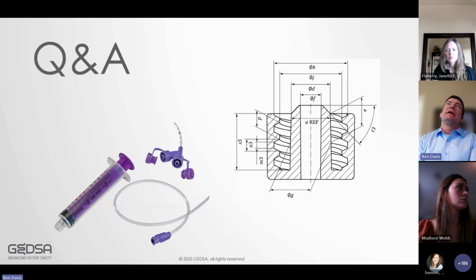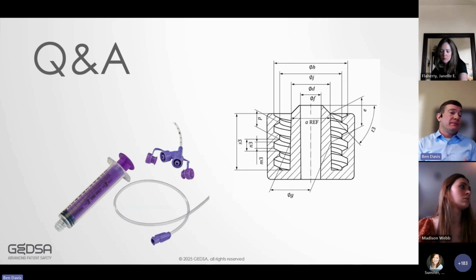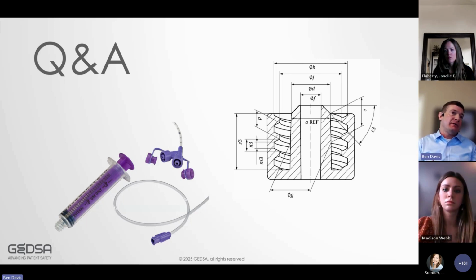But the other interesting thing to consider in that conversation is if you're dealing with a low profile device, you can't see the inside of that connection, but especially on a right angle connector, like on the bayonet fitting, the key that goes in a low profile device is actually the same as, if not sometimes even smaller than, the ENFit through bore. So that's actually the bottleneck in some of these systems. If you have a straight bolus set, in my experience, that's basically the same diameter, so not really an issue there. But there are things that have been done.